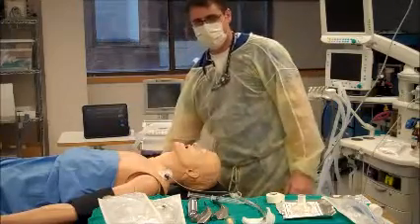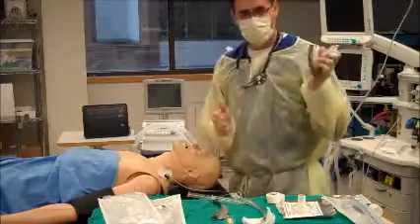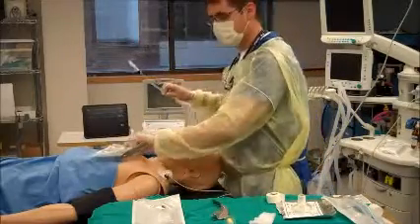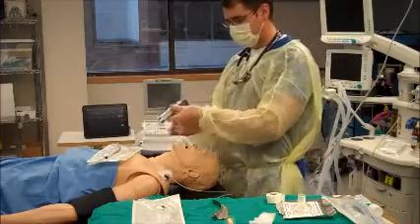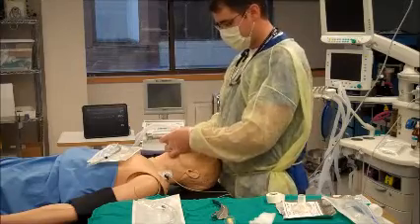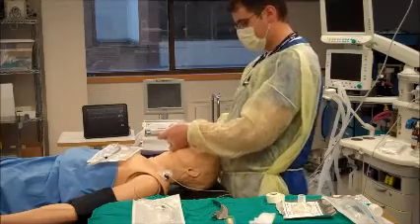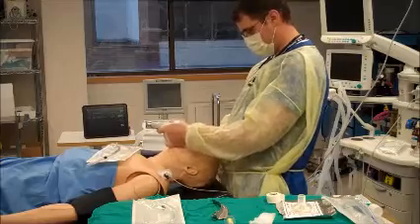My patient is pre-oxygenated, so I'm going to put my resuscitator bag down, open up my laryngoscope, and get my tube that I've prepared with the stylet. My assistant can hold it or I can place it right on the patient. I'm going to insert my laryngoscope on the right side of the mouth and do a big tongue sweep, starting to identify anatomy the second I begin laryngoscopy — I can see the uvula, the hard palate. Using a curved blade, I'm looking for the epiglottis to get into the vallecula space.